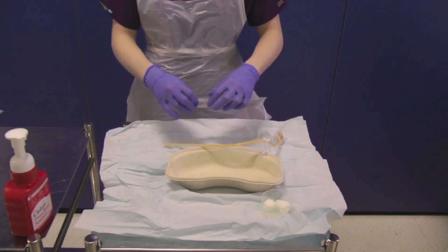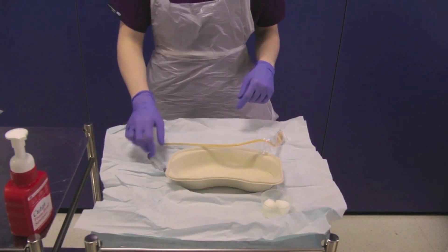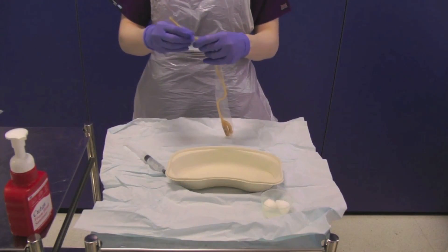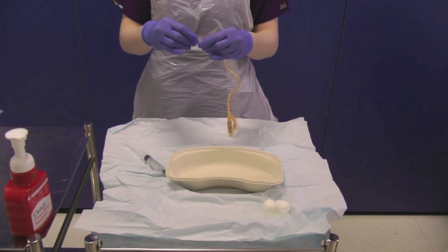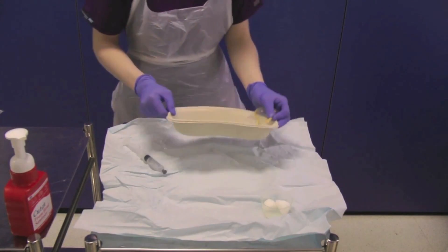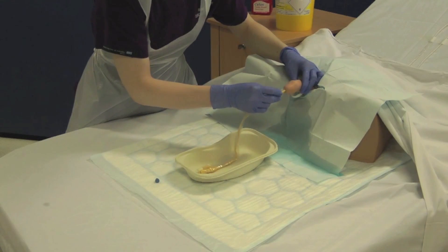Open the 10ml syringe from its sterile packaging and leave this on your sterile field. Open the urinary catheter from its sterile packaging using the perforations to help you, exposing the catheter tip only. Hold this in the sterile J-tray and place onto the bed between the patient's legs, avoiding touching the catheter directly and using the packaging as a barrier.